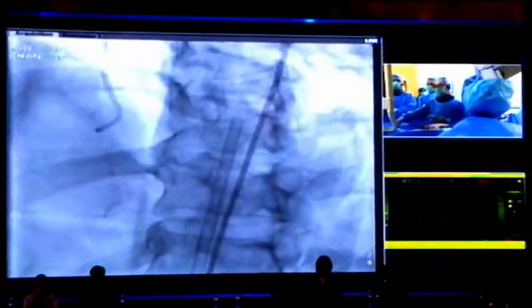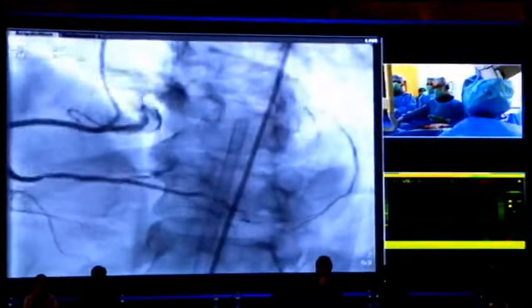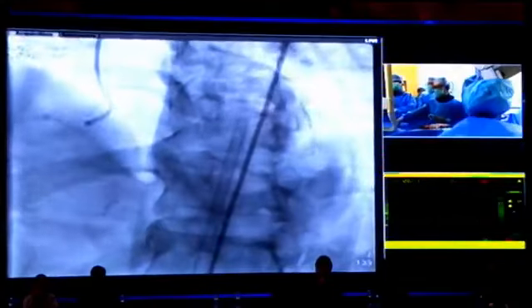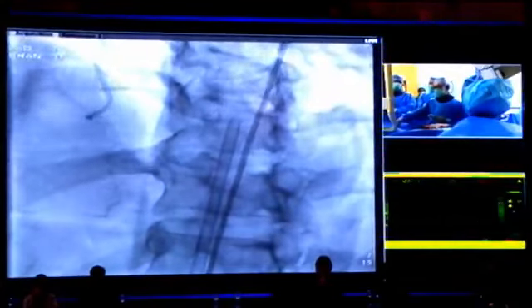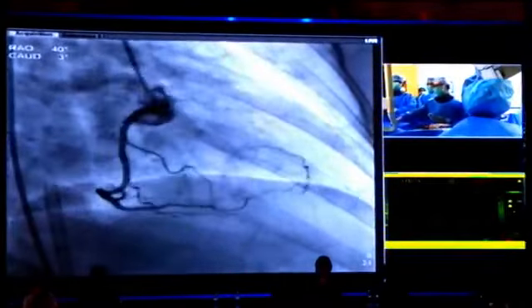But how about this channel, is it interventional or not? I think it is not a good channel, not interventional. So maybe this is the final option for me. I should RAO like this.